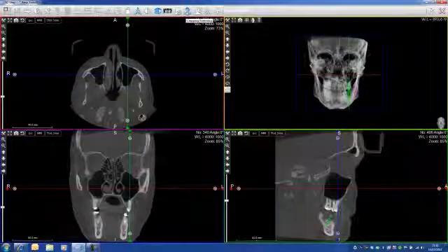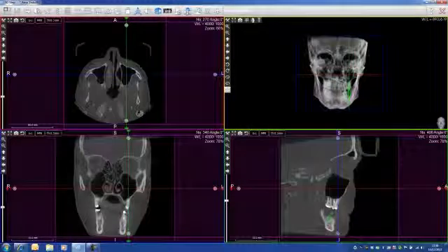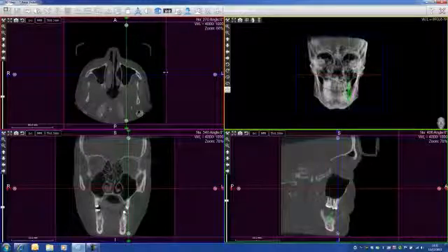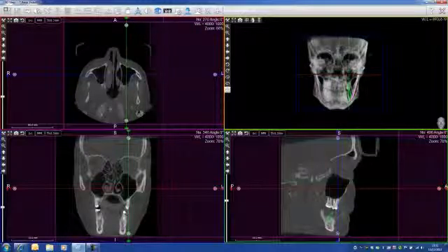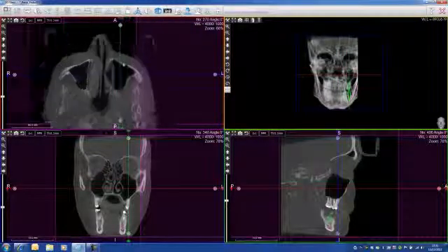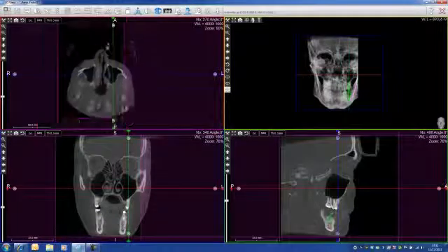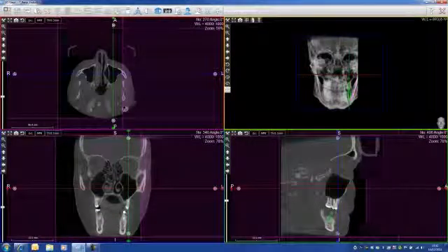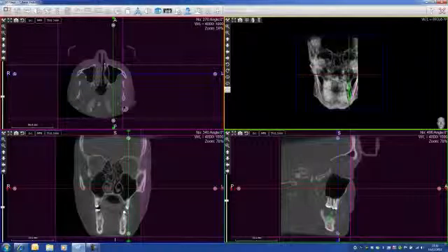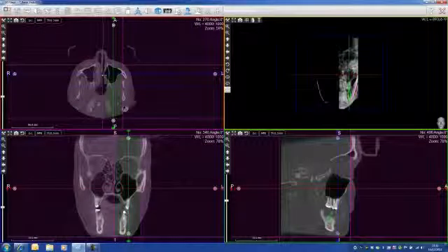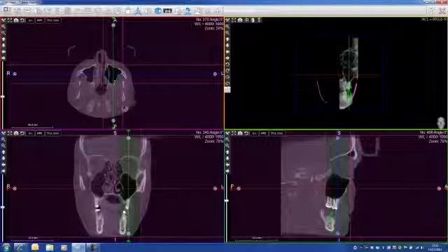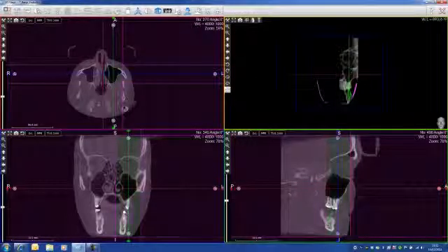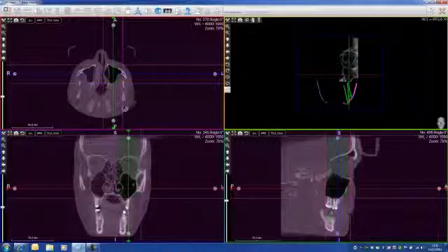And then the trim function — it's called trim or cropping. I click here and I've got this purple line coming up. I take them and try to isolate my sinus. Same here, same here, same here — on all the different views.